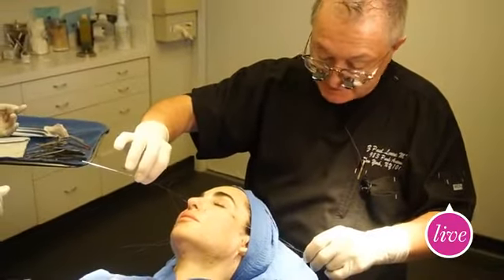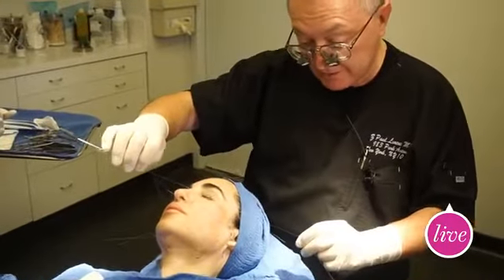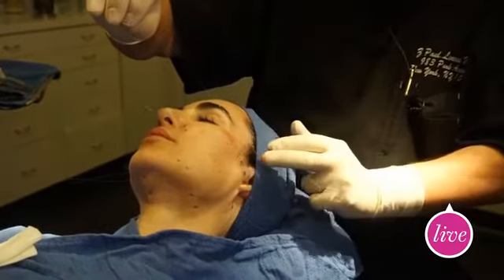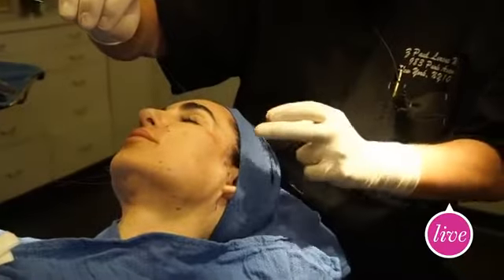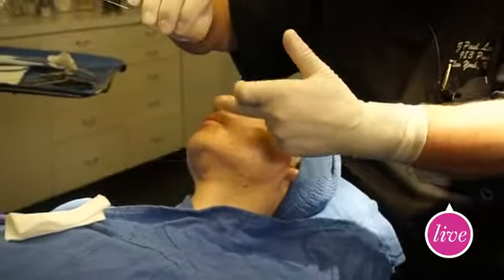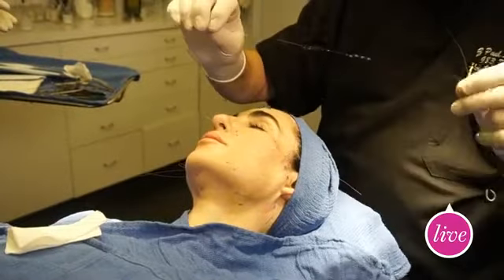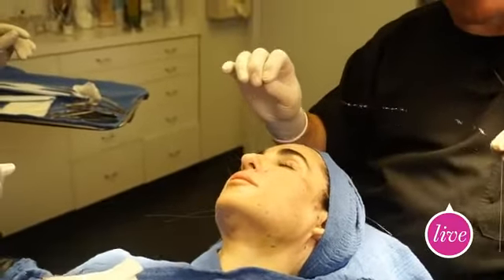You can see that the cones, this is called a bidirectional product or suture, because the cones are directed in 2 directions, bidirectional. And what the cones above are used for basically is the anchoring cones, because this tissue is less mobile, this tissue is mobile. So if you have a difference in mobility of the tissue, this is used as an anchor, and as you saw on the other side, by holding the suture, I'm advancing all of the tissue on the suture, and getting a lift. But also the other very cool thing about this particular product, Silhouette InstaLift, is that this is not only a lifting suture, this is also a volumizing suture.